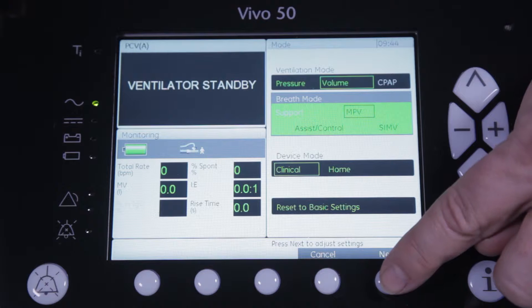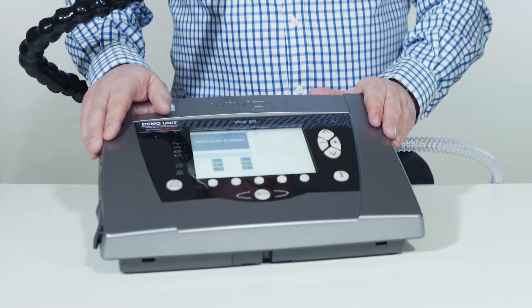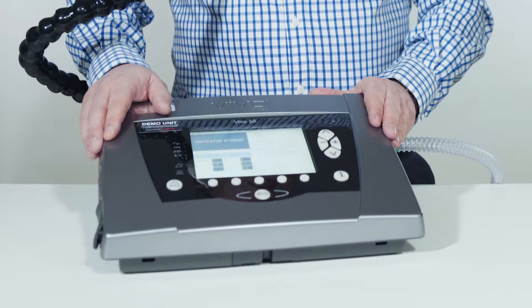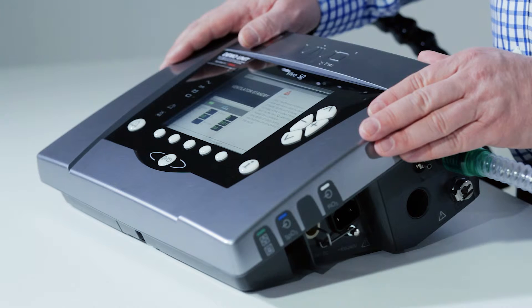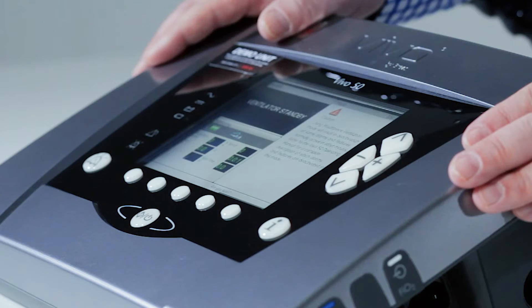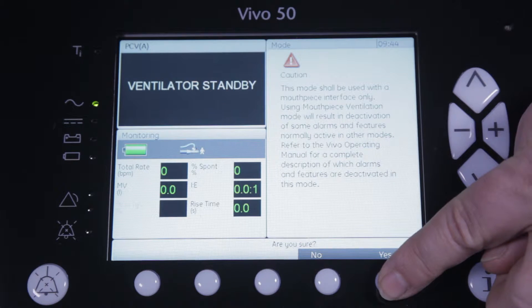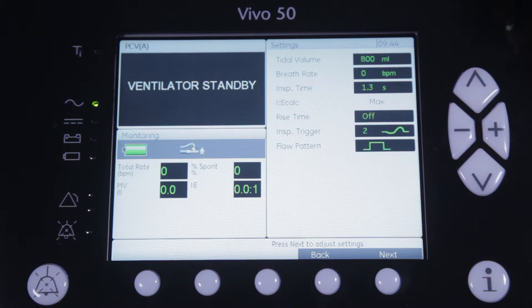By pressing next, the Vivo will automatically guide you to the settings page. But before entering the MPV mode, you will see an information message to inform you about the differences between MPV and the other ventilation modes. Once you have acknowledged this message by pressing yes, you will see all the settings that are applicable for the volume controlled MPV.